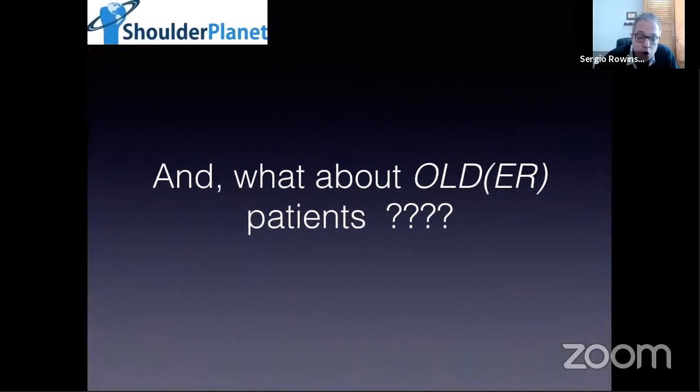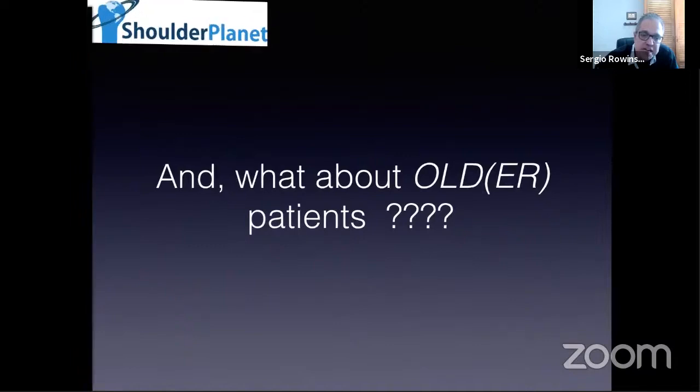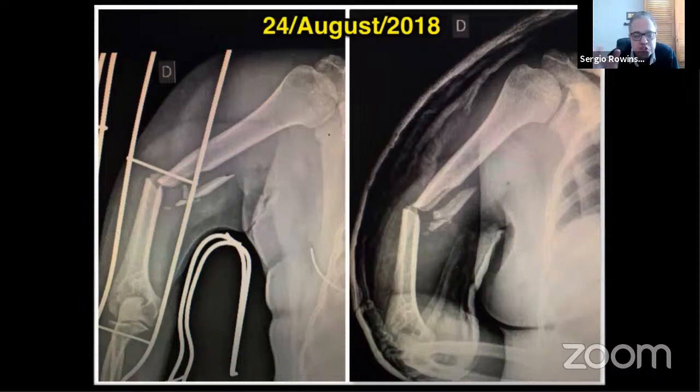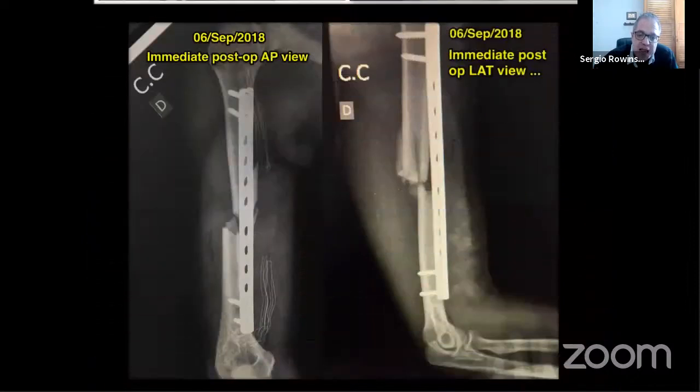So what about older patients? This is my last case. My record is 70 years old, but this lady is 68. So this is, I would say, a short oblique mid-shaft fracture. Can you do it in a 68-year-old? Of course you can. Dr. Belangero was talking about contact.